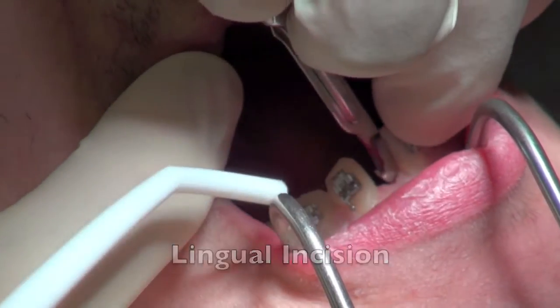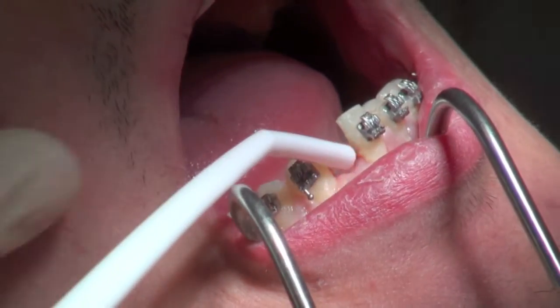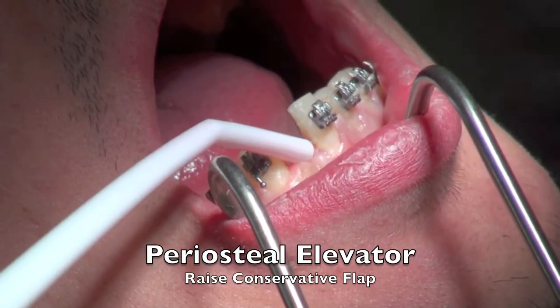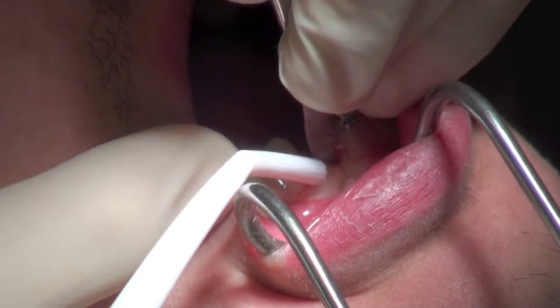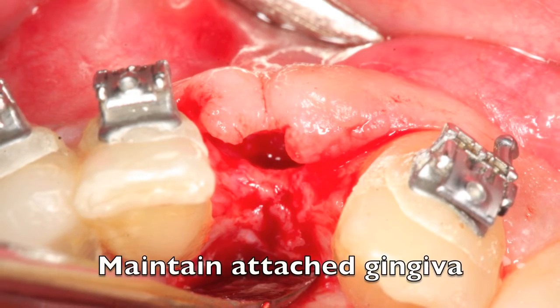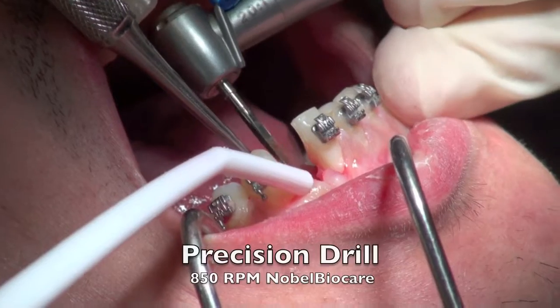A flap was raised using a number 15 blade to reflect the tissue from the lingual area. The flap was cut more lingual than normal to bring some of that tissue forward and create a little bit of a bulk of tissue so that we can create some papilla down the road. As you can see on this overhead view, the ridge was reflected but not completely stripped off of the periosteum to maintain the blood supply.